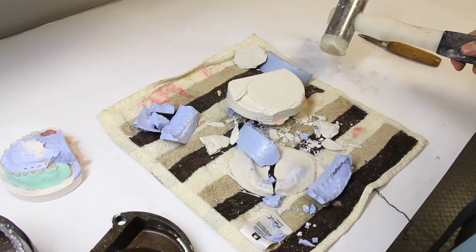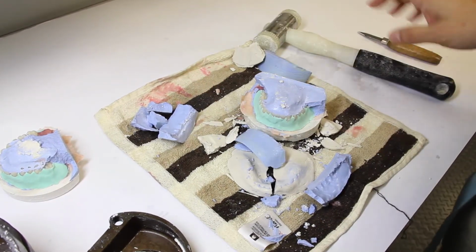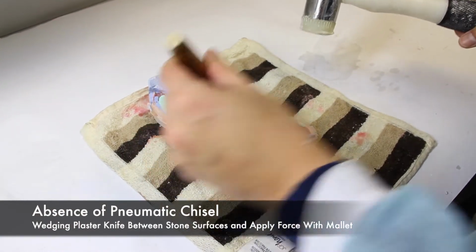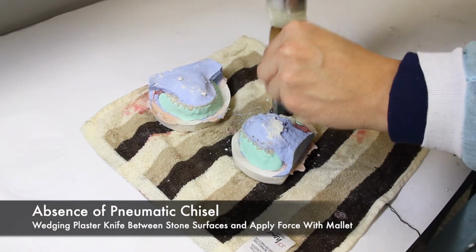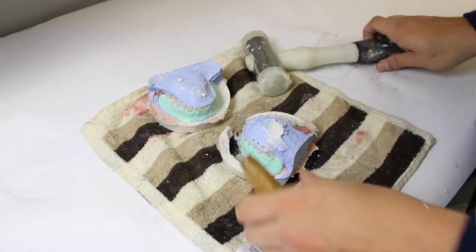Once the stone investment has been removed from the brass flasks, a common tool that would be used would be a pneumatic chisel. In the absence of a pneumatic chisel, you can wedge a plaster knife between the seams of the stone surfaces and apply force with the mallet. The stone should separate easily.